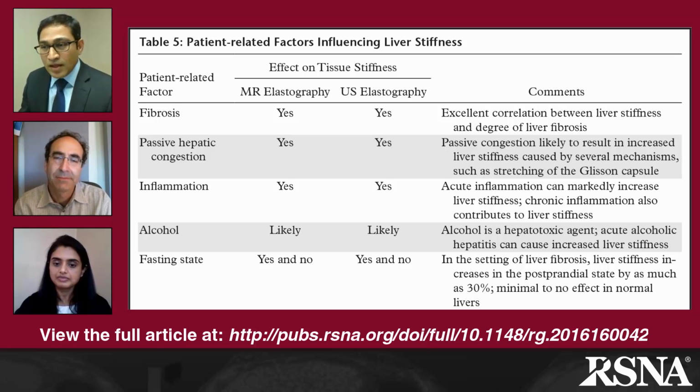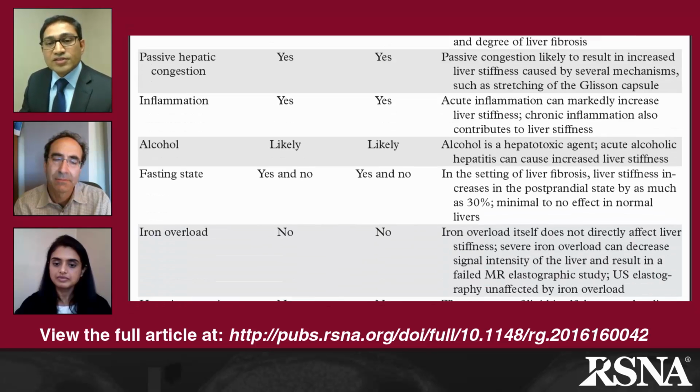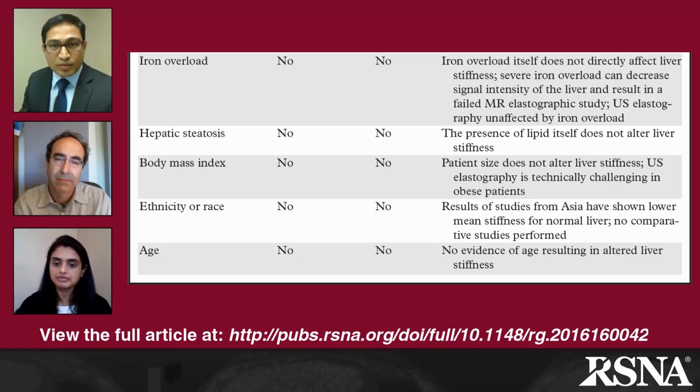The other condition which might affect the elastography techniques, particularly MR elastography, is iron overload, like in patients having hemochromatosis. The standard MR elastography technique which we use is the GRE technique, which is very sensitive to the presence of iron in the liver, and this causes signal loss. Mind you, this does not prevent shear waves going through the liver, but the shear waves are not visualized because there is no signal coming from the liver, and we cannot assess them. So if you have very severe iron overload, MR elastography can fail just because there is no signal from the liver.